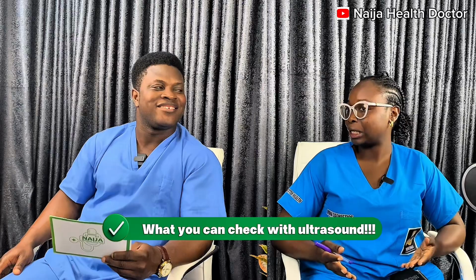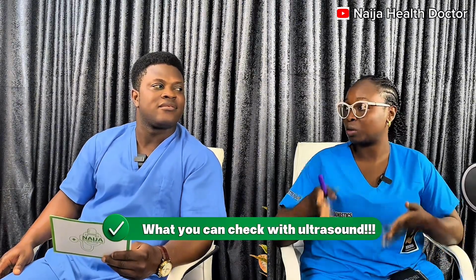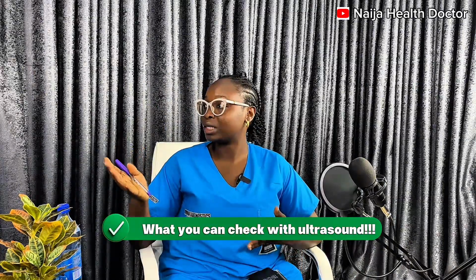Yes. So pregnancy, we have pelvic scan for pregnancy 6 weeks to 12 weeks. Then 12 weeks and above, obstetric scan, endometritis, PCOS, polycystic ovarian syndrome. We have several conditions. Those conditions, we see them clearer on ultrasound.